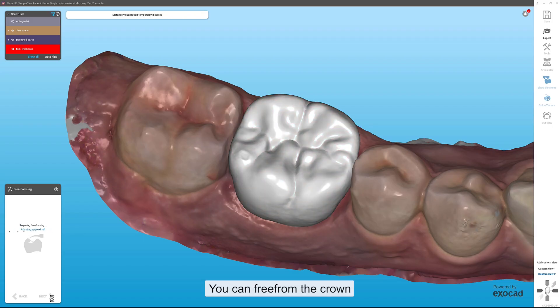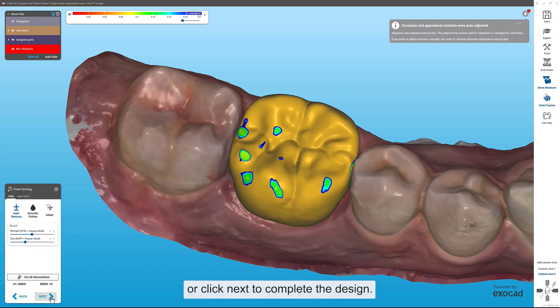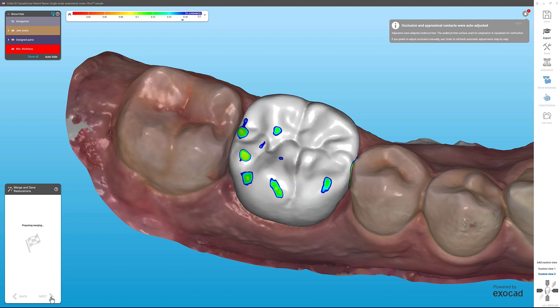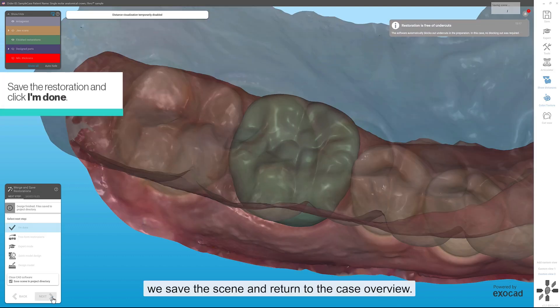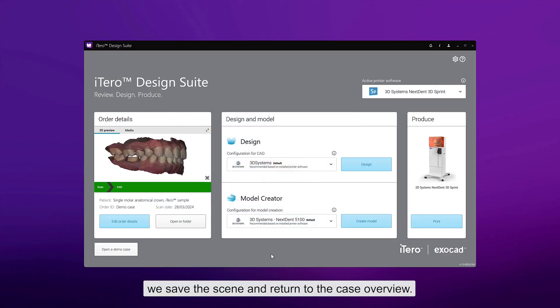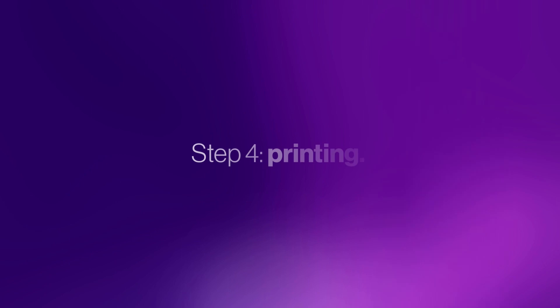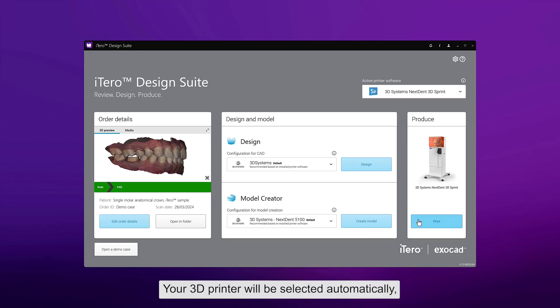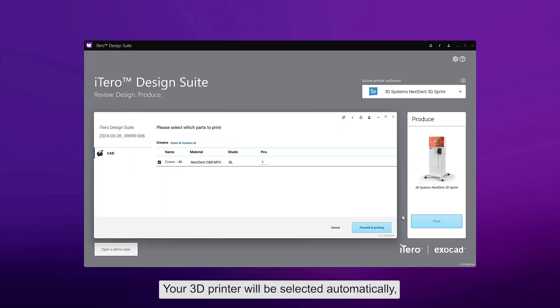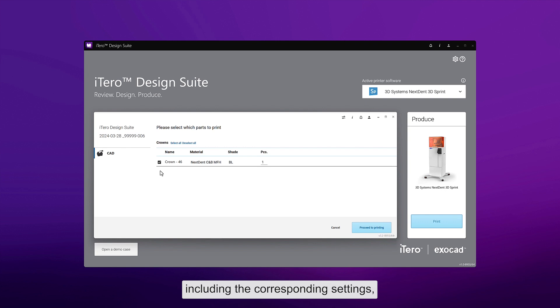You can freeform the crown or click Next to complete the design. By clicking on Done, we save the scene and return to the case overview. Now you are ready to proceed with printing. Your 3D printer will be selected automatically, including the corresponding settings.